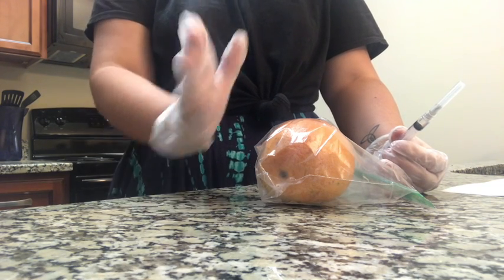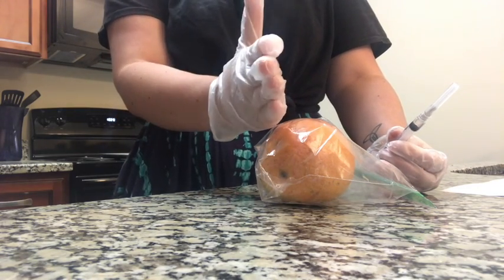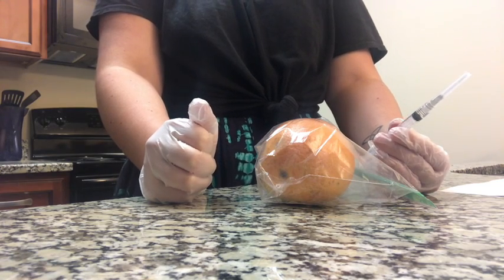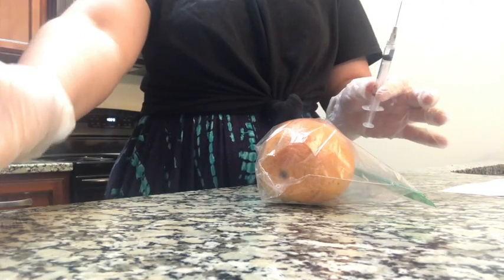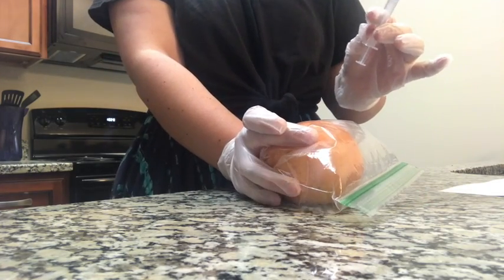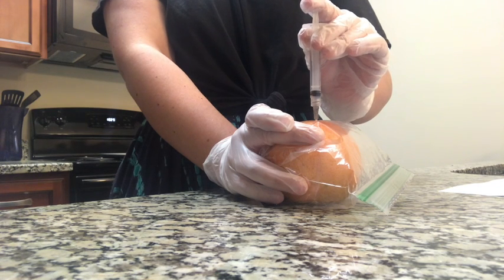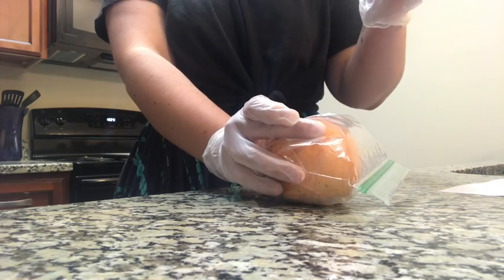I also would be performing the Z-track method, pushing the skin with my hand, administering it, and then letting go at the same time that I pull out. Okay, this is going to be dry now. I'm going to take this off, straight off. Hold the skin tight. Administer at a 90-degree angle. Hold it. Out.